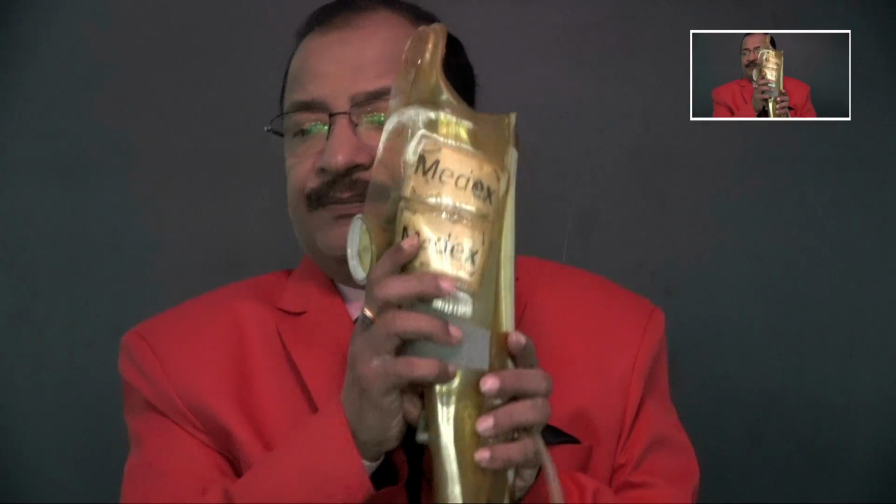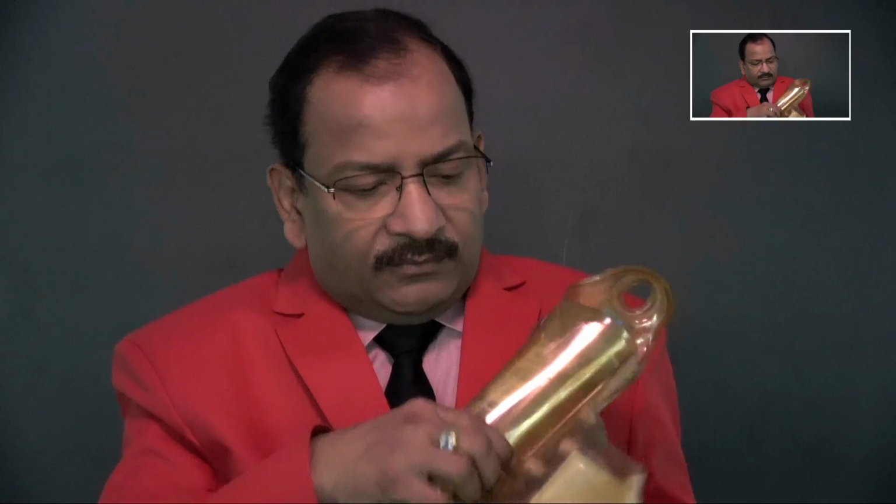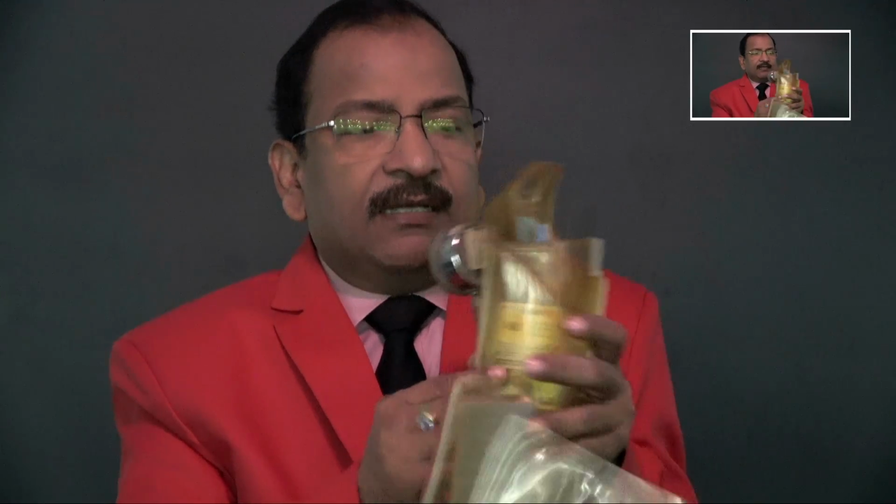This is the Medex pump. It is by the Medex company, and it has a pressure meter, and this is red color. Inside, you can wrap the bottle. Here we have a normal saline bottle, and you will wrap it like that, and this will hang, and this is called the Medex pump.